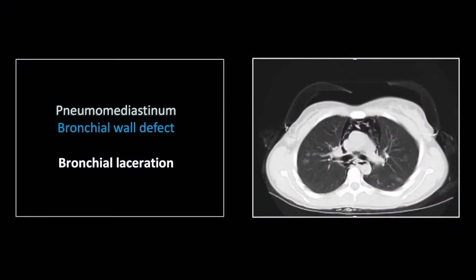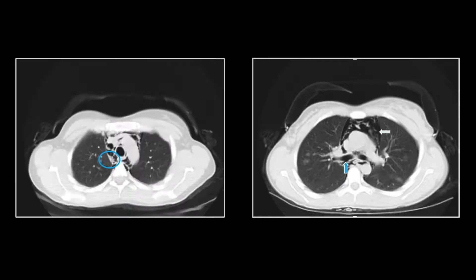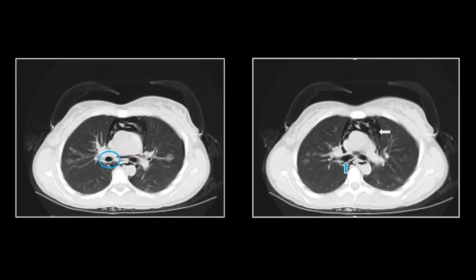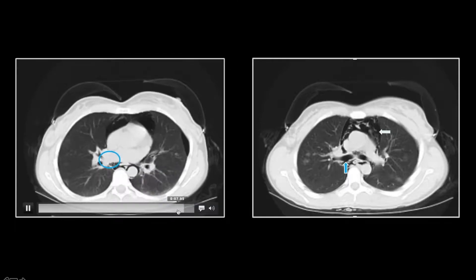A fairly similar case is this bronchial laceration. You can see again extensive pneumomediastinum. On the posterior aspect of the bronchus intermedius there is a focal defect. This was traumatic, and you can see small foci of ground glass density in the pulmonary parenchyma as well. The movie allows you to track the bronchial wall and see that defect very nicely.